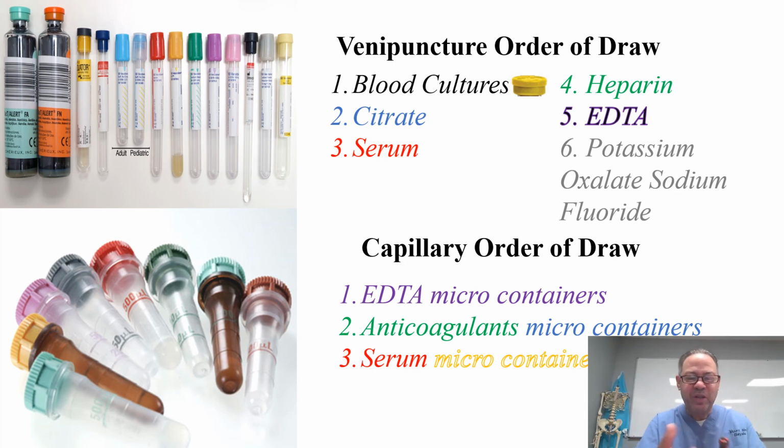So when the doctor received the test result, oh no, your potassium is fine. I thought your potassium was wrong. And that is a wrong test result. So, por no seguir el orden de extracción, ¿ok? Tú sacas este tubo primero normalmente para los electrolitos como el potasio y después tú sacas este tubo para el conteo completo de glóbulos rojos, de glóbulos blancos y plaquetas, lo que se conoce como el complete blood count o el hemograma.